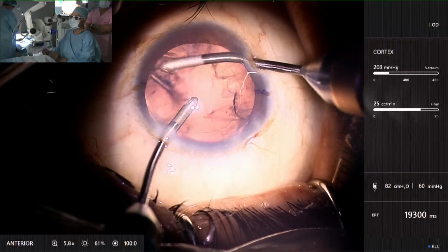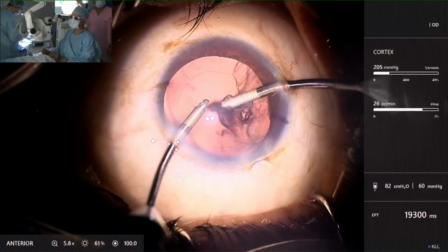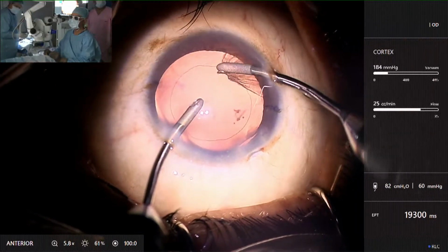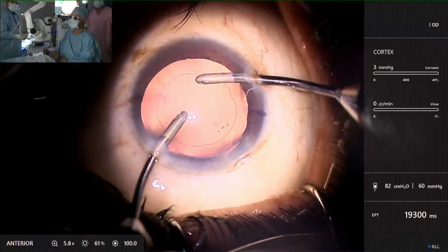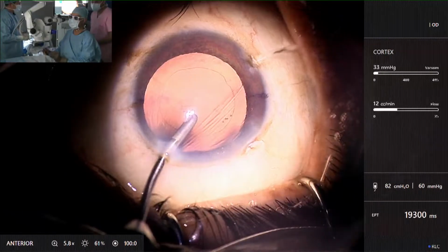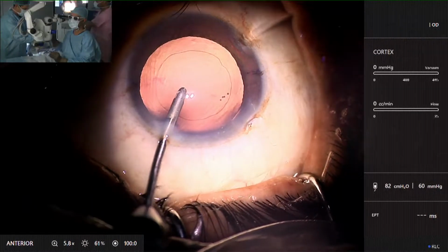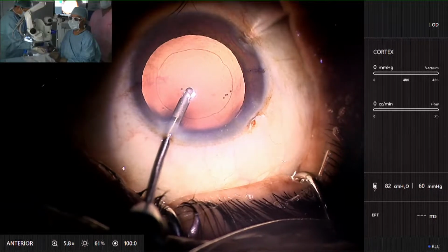So he was remembering Narendra's name and repeated it four or five times. He also remembered the patient's name, Bhattji. So you can see that the cortex was gone in a few moments, and now I'm going to do a hydroimplantation. Dynamic surgery.